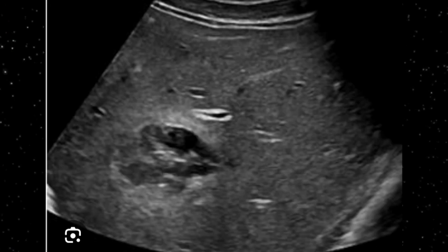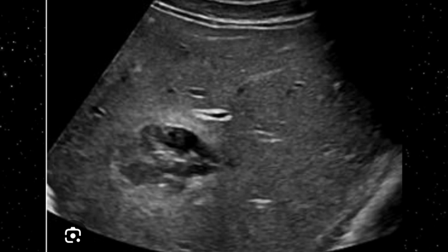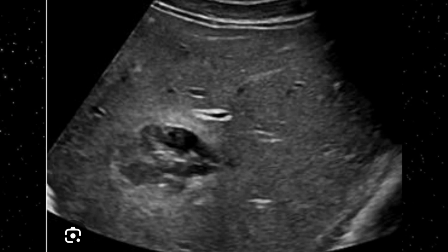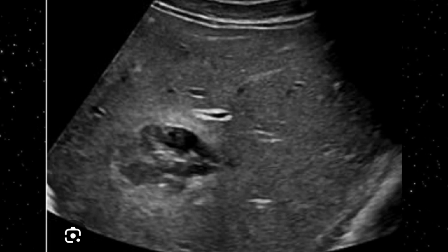In another example of intraparenchymal hematoma, this is quite clear and you can easily pick it up, and the surrounding area still shows some level of hemorrhage. This is the right lobe of the liver on a transabdominal scan, and this facility is available in the post-traumatic emergency unit.